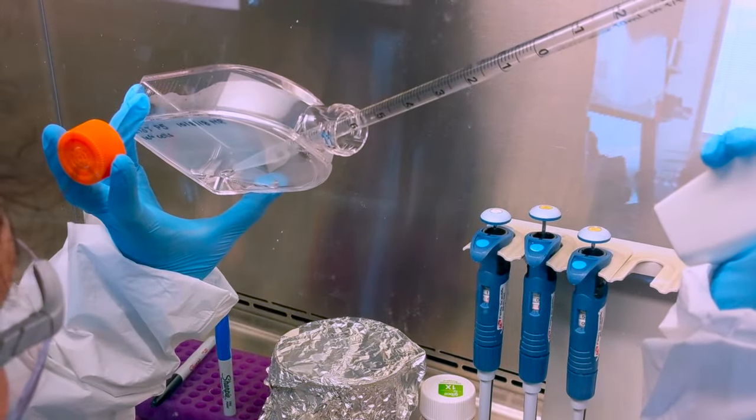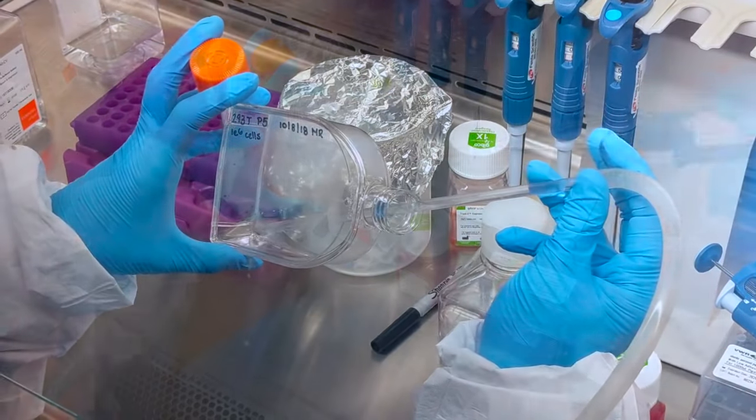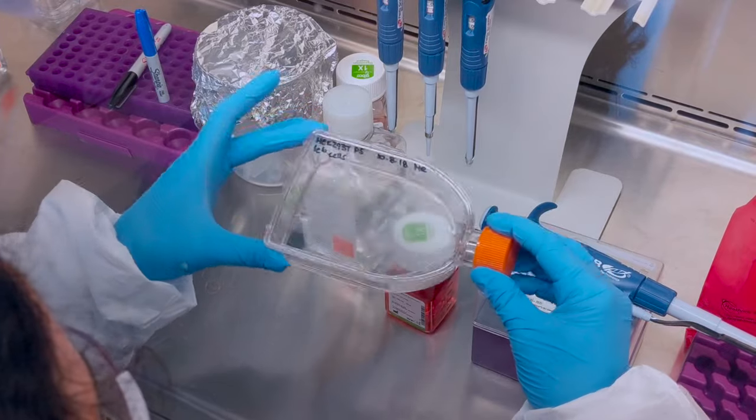While undeniably valuable, learning basic tissue culture technique can be a daunting task for those new to the lab and veteran scientists alike. In this instructional video, we will provide some best practices and advice for those new to tissue culture.